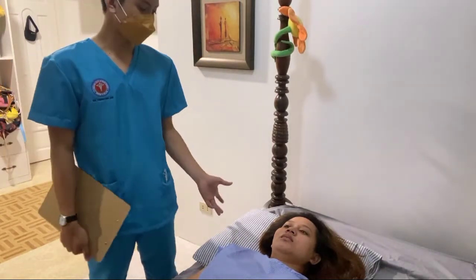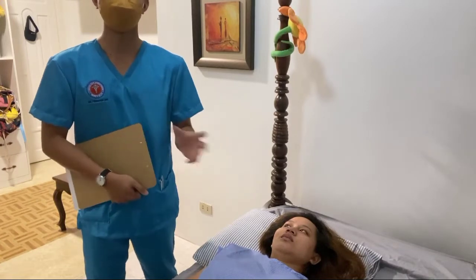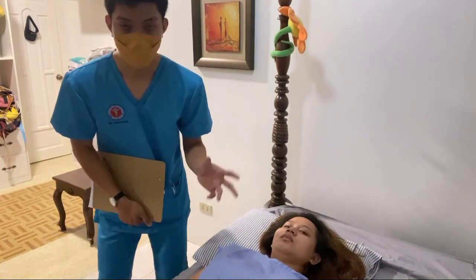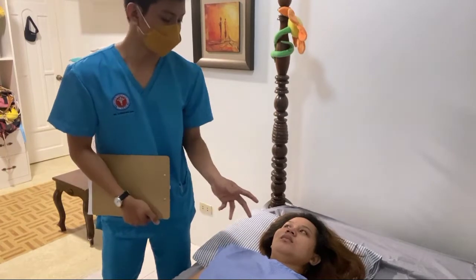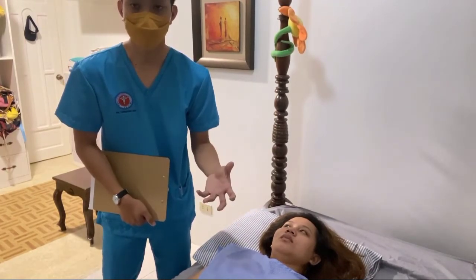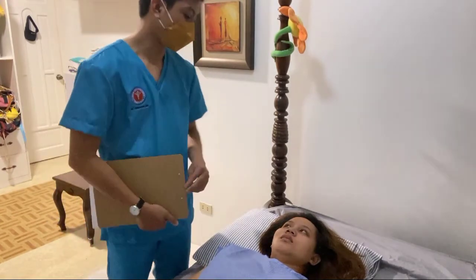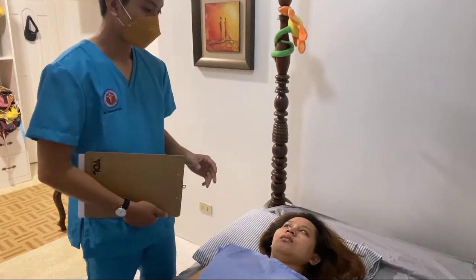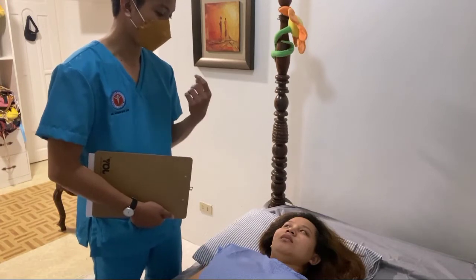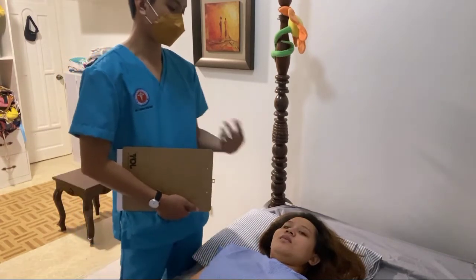We're also assessing the willingness of the patient to self-administer the medication. We ask the patient whether she prefers to self-administer or have the nurse administer it for her. The patient agrees to proceed with nurse administration.